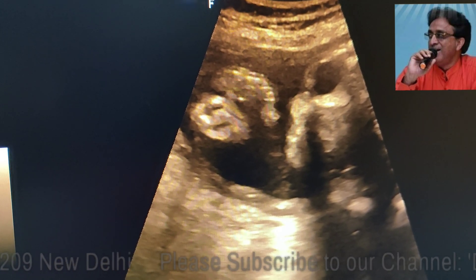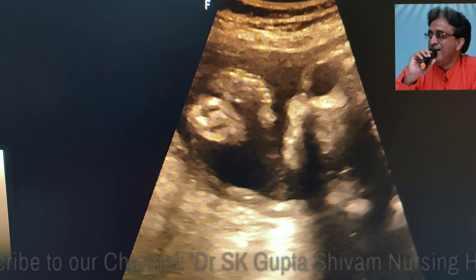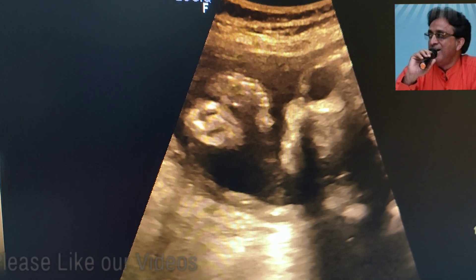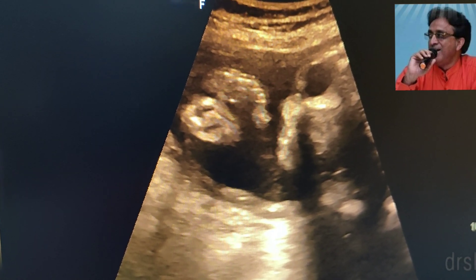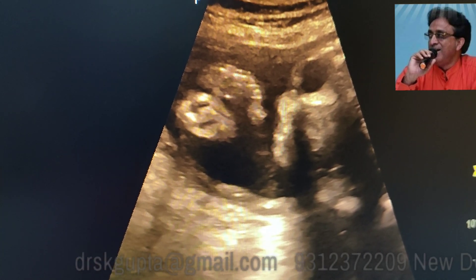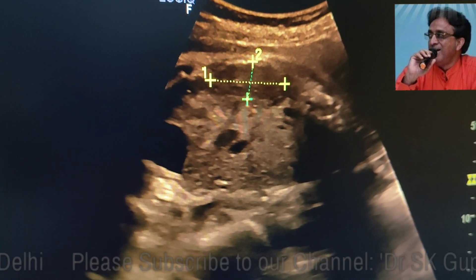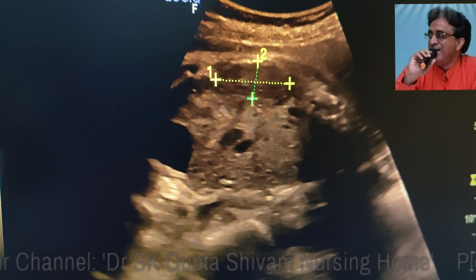When we started looking at the patient, we found that the amniotic fluid is normal. Usually in patients with IUGR the amniotic fluid may be less, but here the AFI was 13.5 centimeters, suggesting that the kidneys are normally functioning and the heart is also normally functioning. We could find that the bladder of the patient is very well filled and there is no issue with the kidneys, which were normal in size.